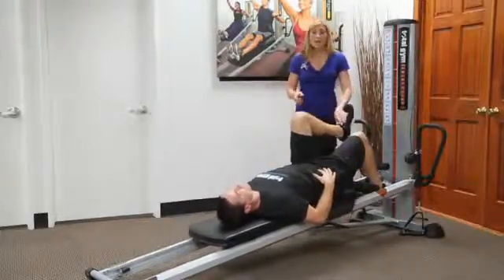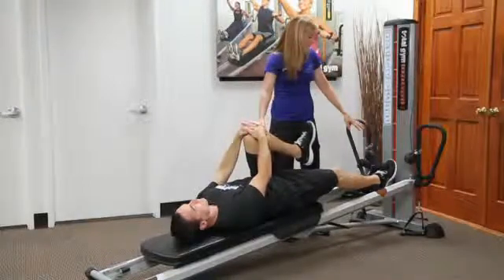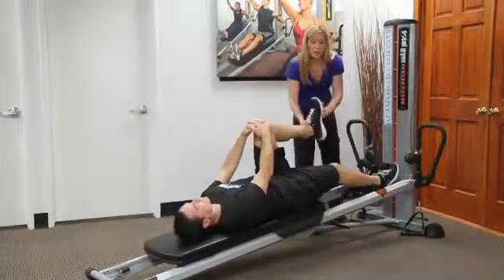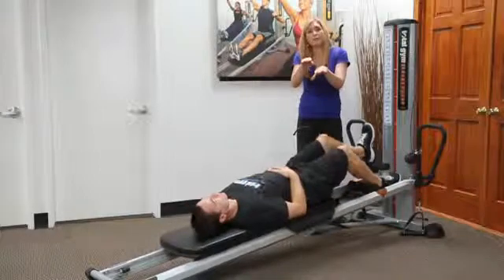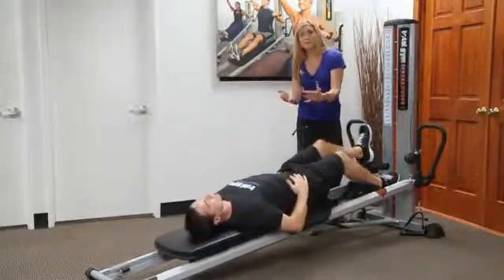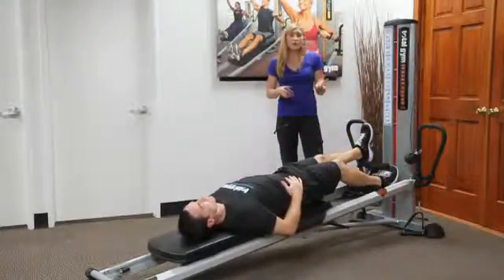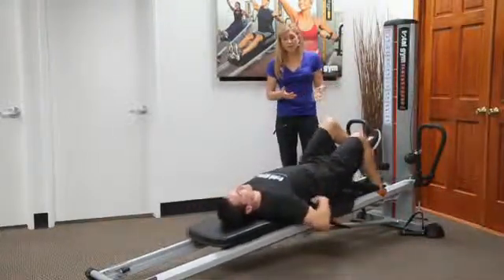So I can either have his knee into his chest, which requires greater strength requirements, and that helps stabilize his spine, or I can bring this leg all the way out, bring it here, and maybe just that little bit of having the leg come up allows for the pelvis to stay a little bit more stable and the spine to stay neutral. So the element of mobility will also go into where the most important factor is how much range of motion they have in pulling up.